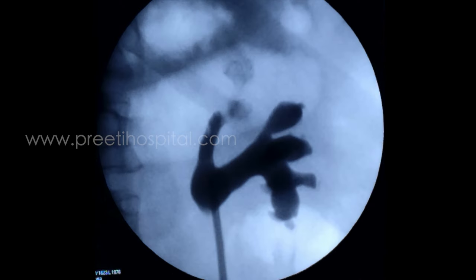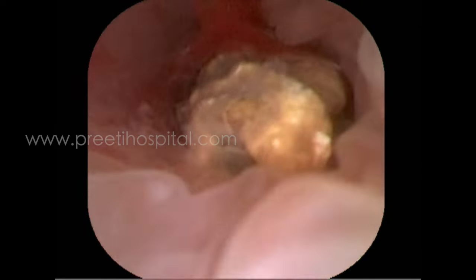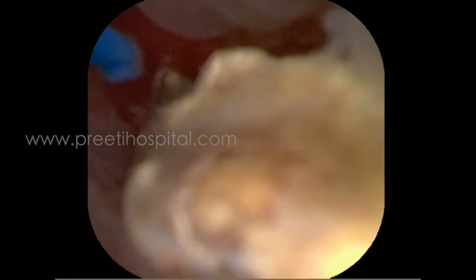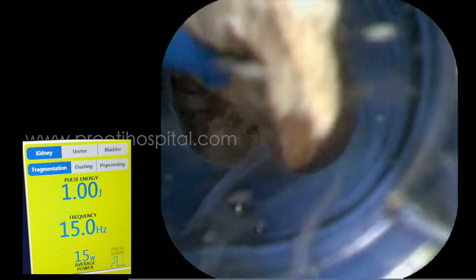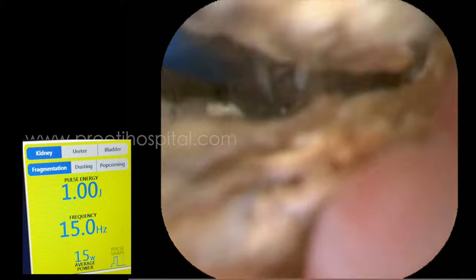See the bifid system. Sometimes PCNL can cause bleeding, but here there was little edema. Just below it is the access sheath, like in PCNL. The only thing is that the ureter should be accommodable, and it is very much accommodable. With this experience of 15 years, whether the ureter will be damaged or not, you have to assess in the beginning only. See, every fragment comes out, almost like mini perc.